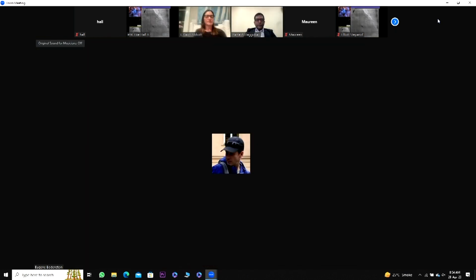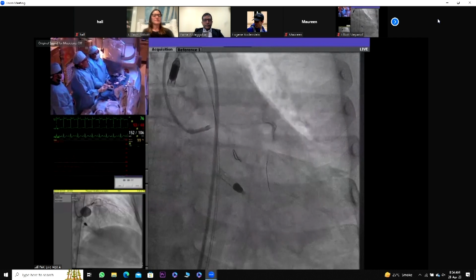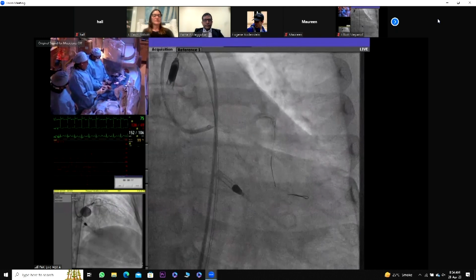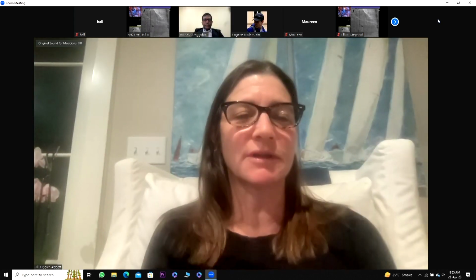Yep. Right. So our step here is we're going to go ahead. We've crushed our side branch, and I want to make sure, there we go. Now, rewiring this side branch in the left main, in terms of the struts you would be looking to rewire through, distally or proximally, can you elaborate on that? Yeah, Dr. Chen? I love that debate. Quite frankly, as long as I get the wire down, I've never adjusted it. That's my honest answer. Yeah, I think anything but extremely distal is fine.